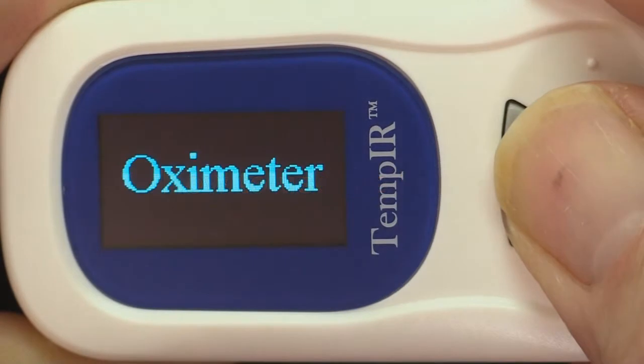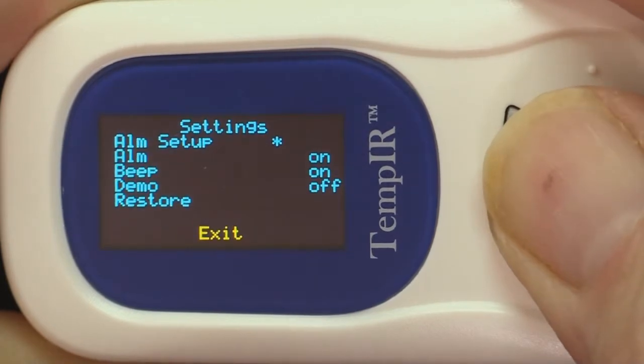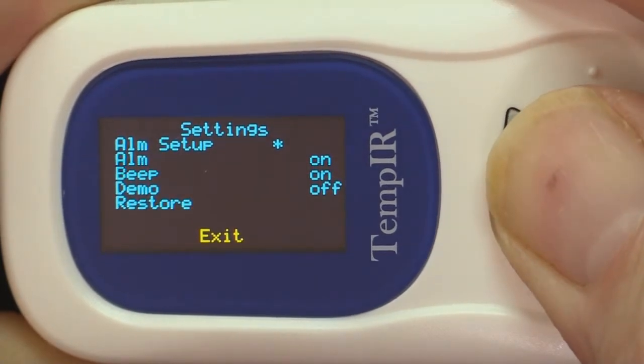In this video we will demonstrate how to access the menus and change the settings. Instead of just clicking, press the button for slightly longer to open one of the two menus. One menu is for setting the sounds, the other the alarm values.